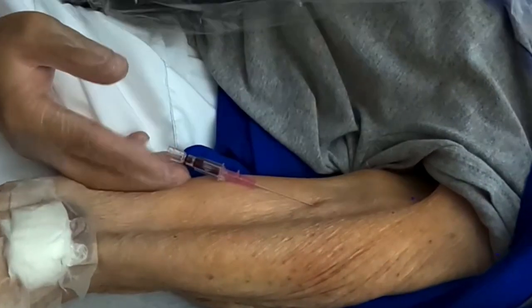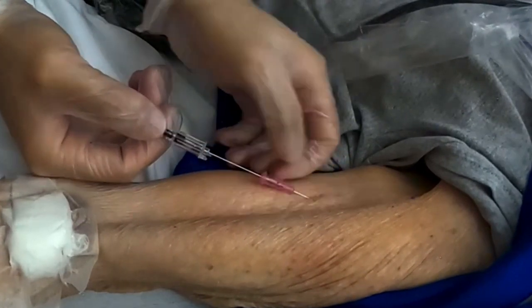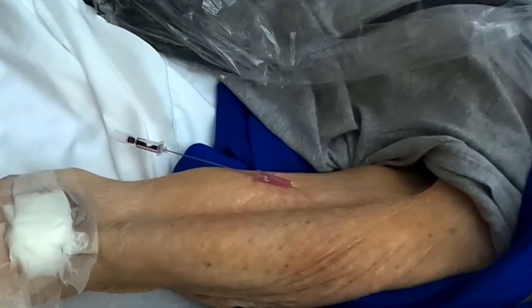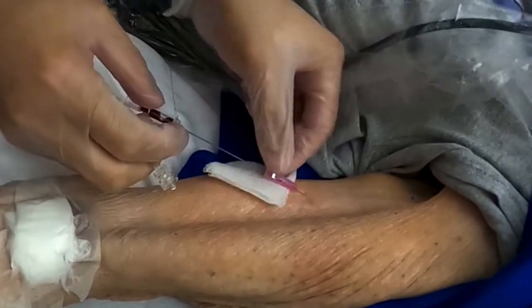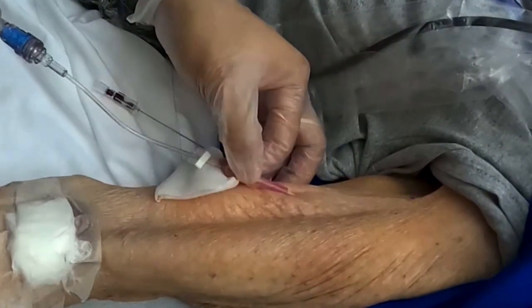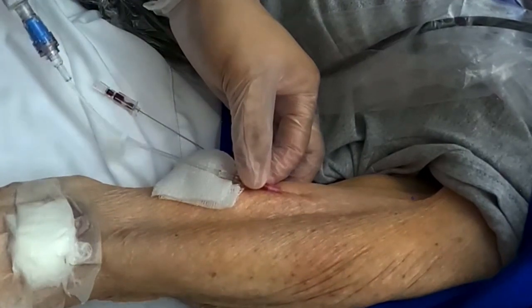So now I'm gonna attempt to advance the catheter. Nice and smooth, consistently smooth. No changes, no variation. Okay, now, I should have gotten more blood return in that, but I didn't. So I'm kind of concerned that we didn't puncture, or we punctured through somewhere not supposed to. So I'm not getting good blood return. There it is. Thank you. You're welcome. Good blood return, good flush.